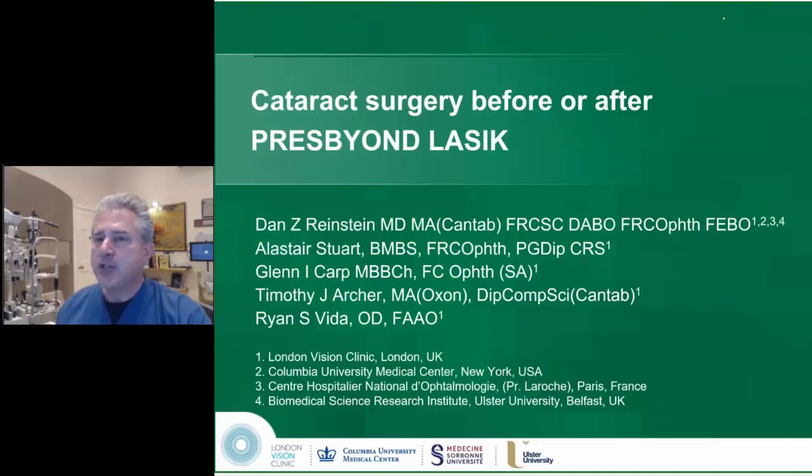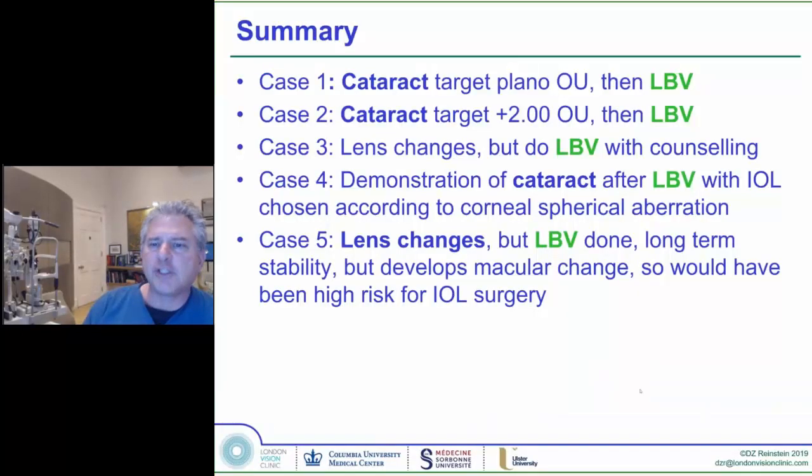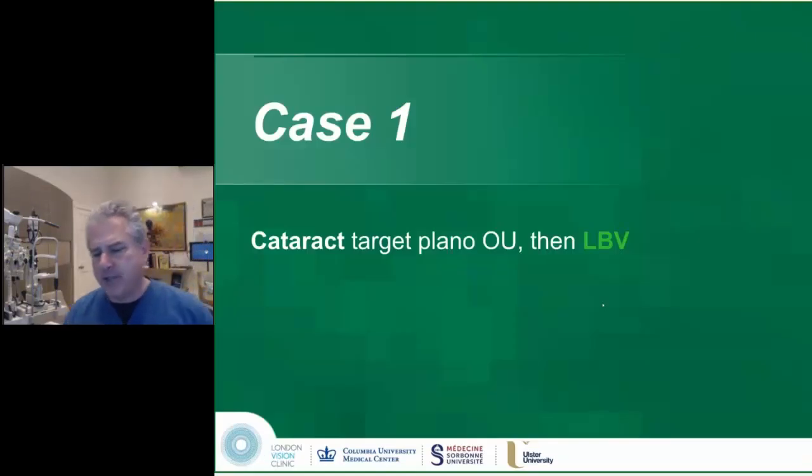Okay, so let me go through this. This is usually a part of our course. I'm going to go through it a little bit faster than usual because I can't keep you here all night. But Alistair, who's our cataract department head, usually gives this talk. So I'm going to give you some scenarios of the interaction between PRESBYOND and lens surgery.